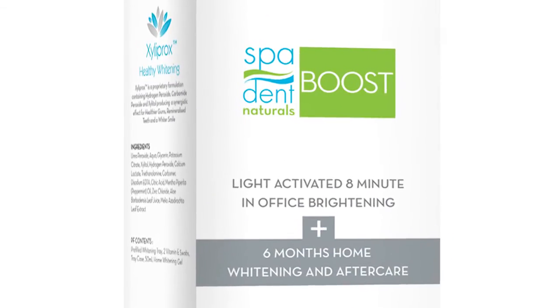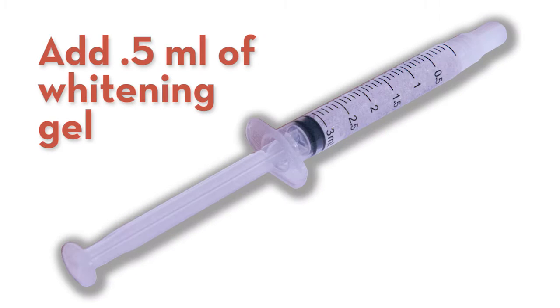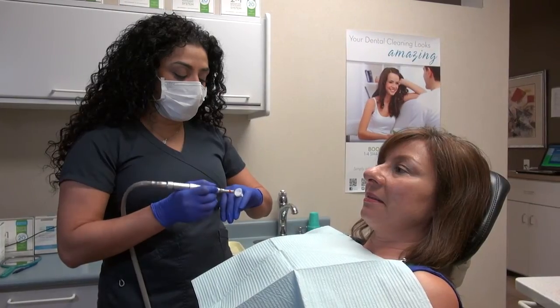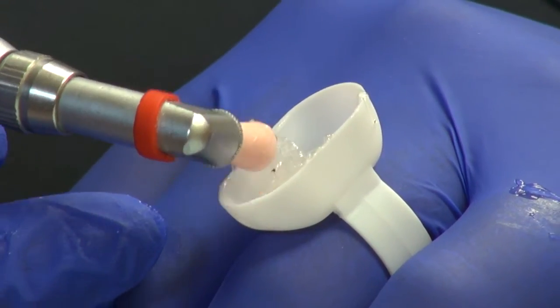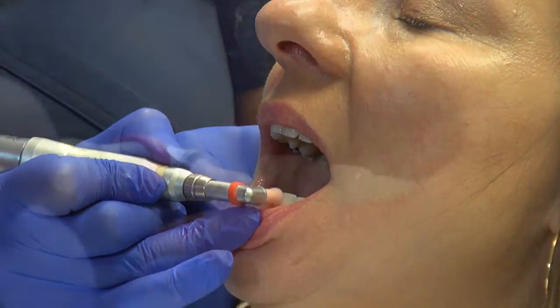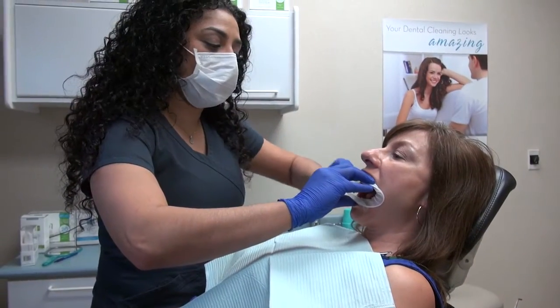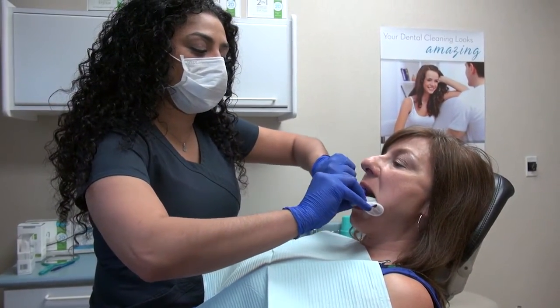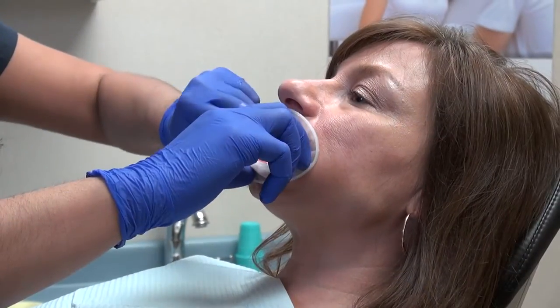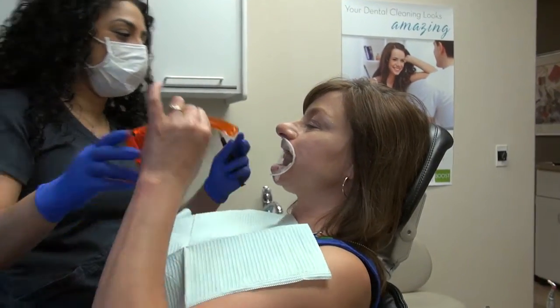Prepare the patient's teeth for their boost treatment by adding 0.5 milliliters of whitening gel from the treatment syringe to prophy or pumice in advance of the boost treatment. Polish the patient's teeth beginning on the 6-6 smile area top and bottom and then polishing as normal. Insert the OptraGate cheek retractor into the patient's mouth. Advise the patient to relax their cheek muscles for maximum comfort.